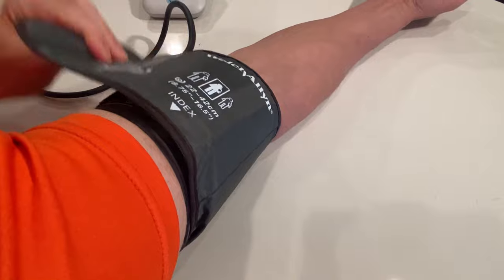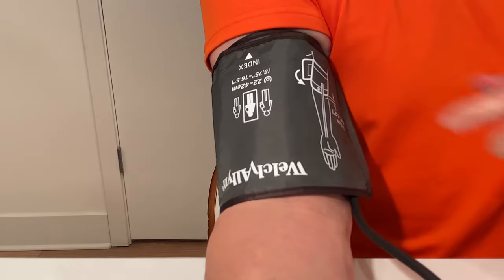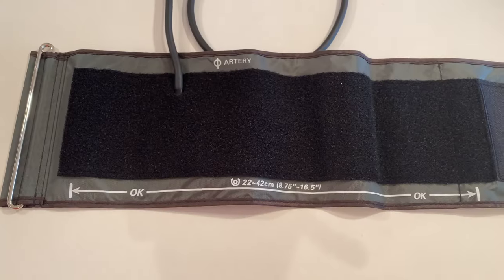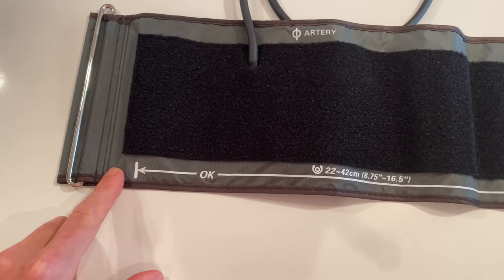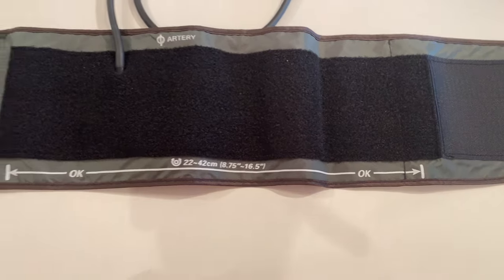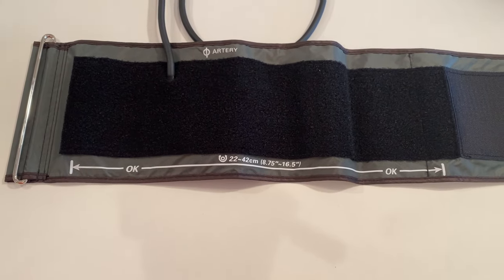The arrow and size range line is there to help make sure the cuff is the appropriate size for your arm. When the cuff is secured, if the cuff is the correct size, the arrow will point somewhere on the line. If the arrow is pointing to either side of the line, then the cuff is either too small or too large for your arm.